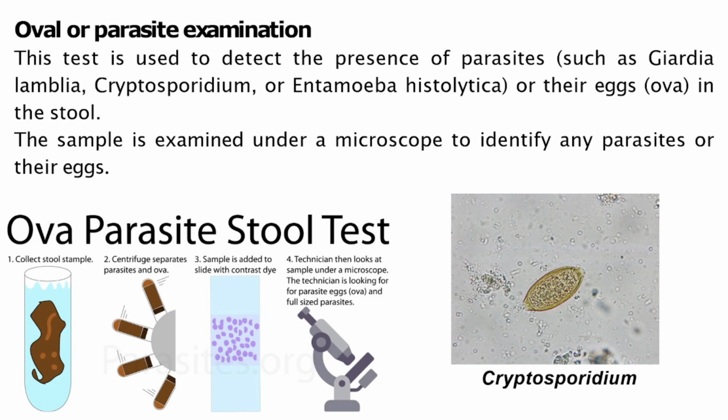The sample is then stained with the specific dye. Then the laboratory technologist will carefully scan the slide looking for the presence of parasite eggs, larvae or adult forms. After staining, techniques may be used to enhance the visibility and improve the identification process.